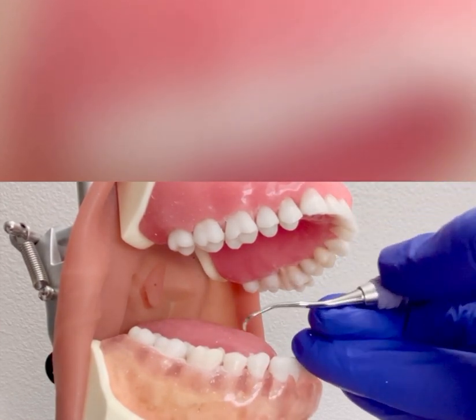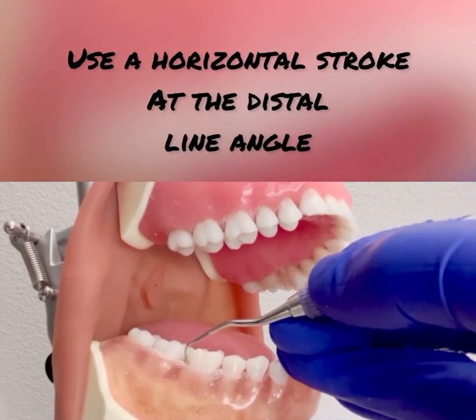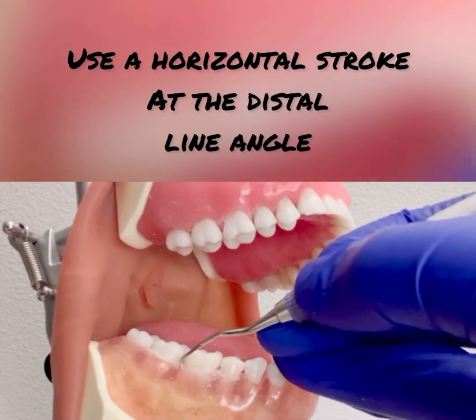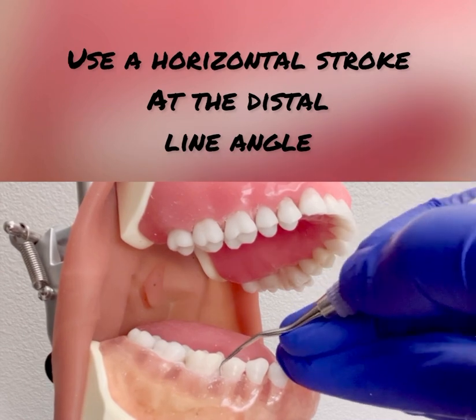Once all the posterior teeth are complete, go back with a horizontal stroke right at the distal buccal line angle. The reason for this is that it is a commonly missed area for calculus.